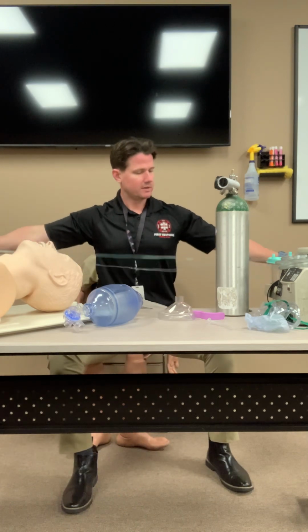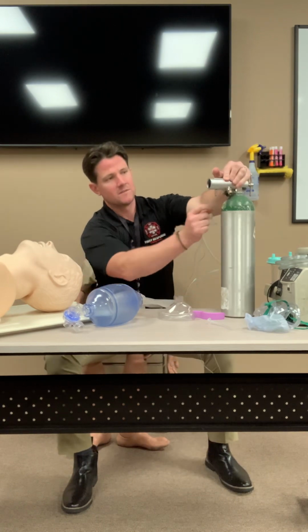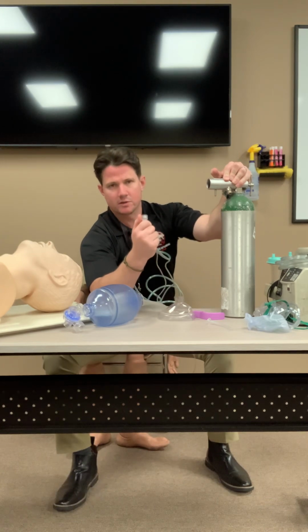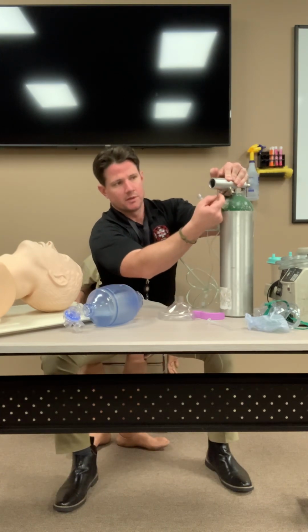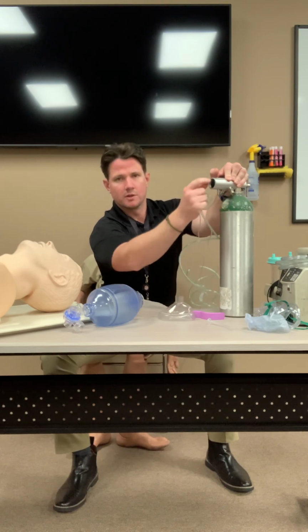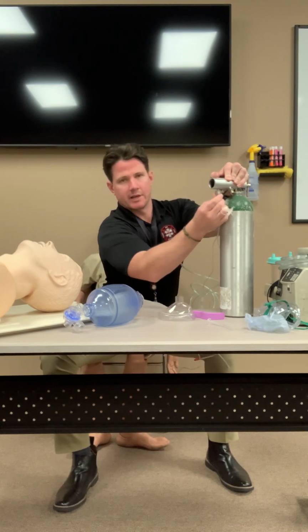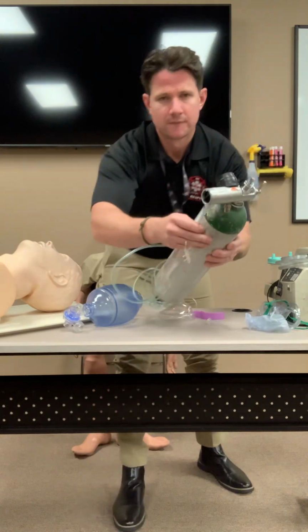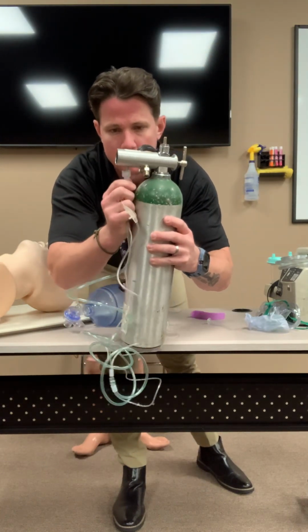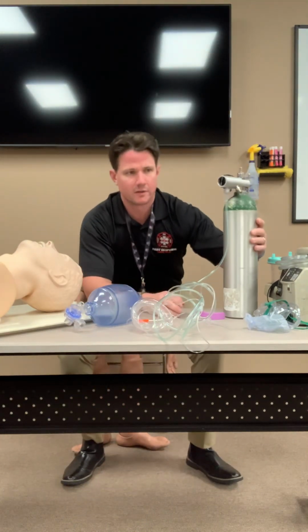So I'm going to take my nasal cannula, the opposite end, and I'm going to connect it to my regulator, all right? You may see a threaded coupling or fitting on the regulator. That is not what the nasal cannula goes onto. It goes onto the little tip that is just below the flow meter, okay? So you're just going to push that up and on, right? Put it on there nice and snug. You don't have to strain yourself, but get it on there nice and snug.